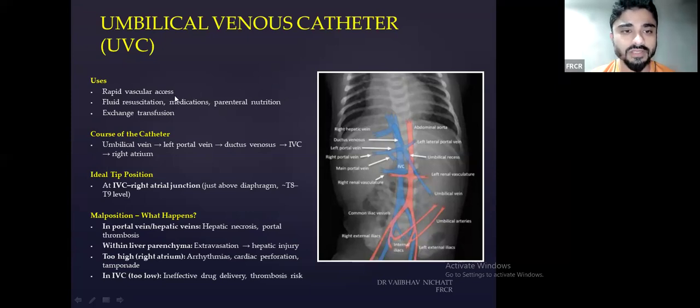Okay, what are the uses of UVC? Rapid vascular access, fluid resuscitation and medications, also used for giving total parenteral nutrition, also for exchange transfusion. What is the course of the catheter?